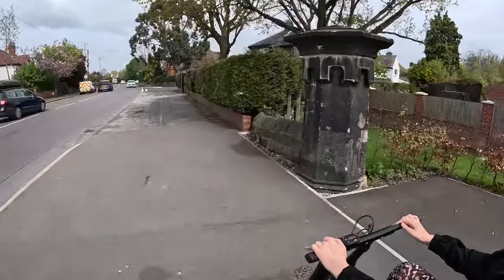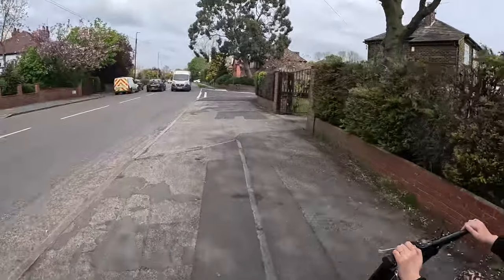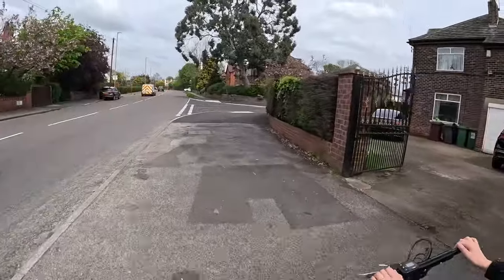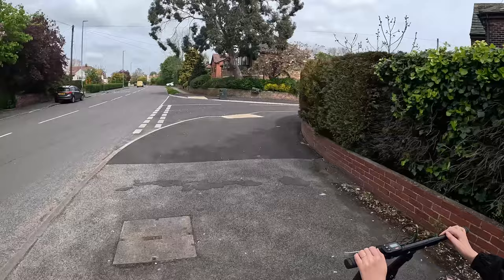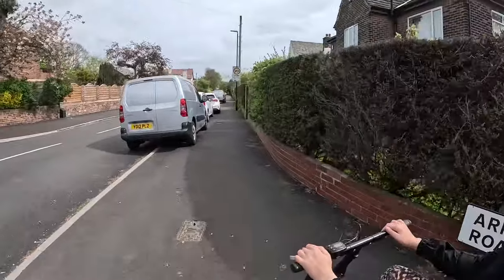Hello, welcome to Adapting Health. Today we're going to talk about the Klaxon Mini and give a bit of a review after about a year and a half of using it quite consistently. It's quite a lightweight bit of kit.